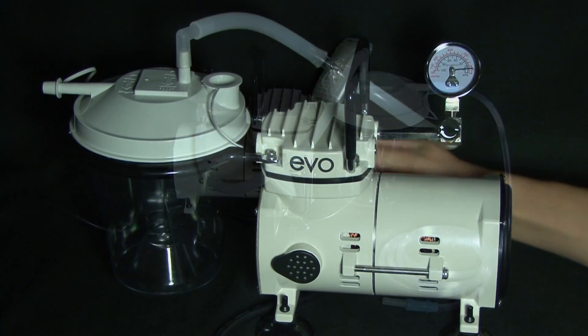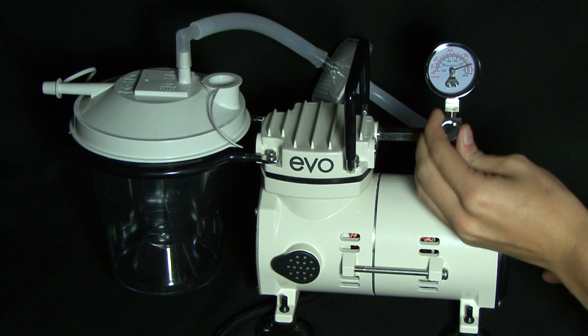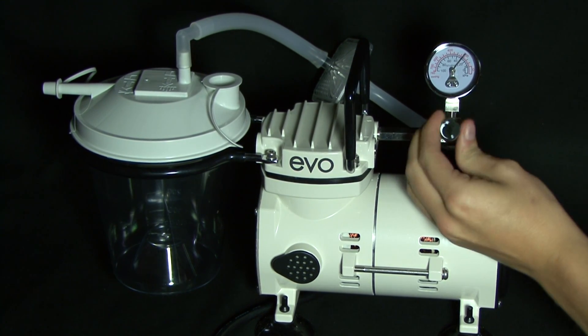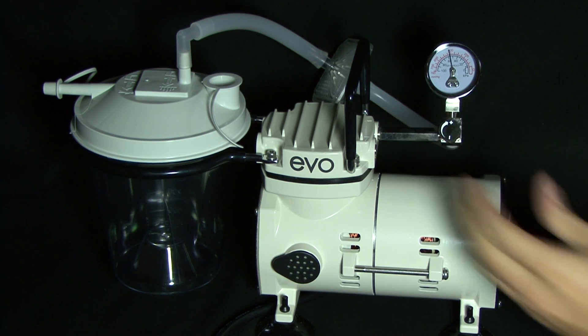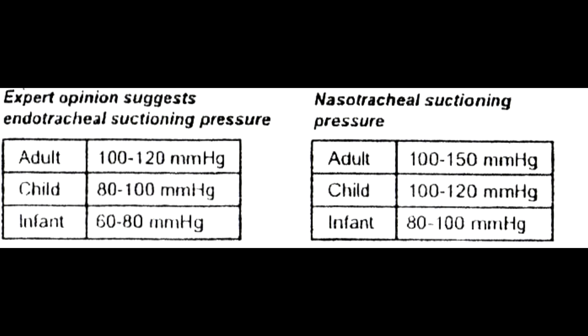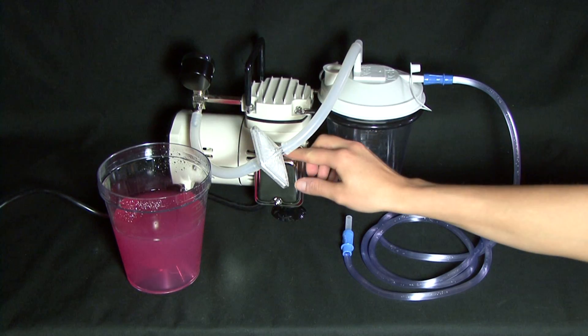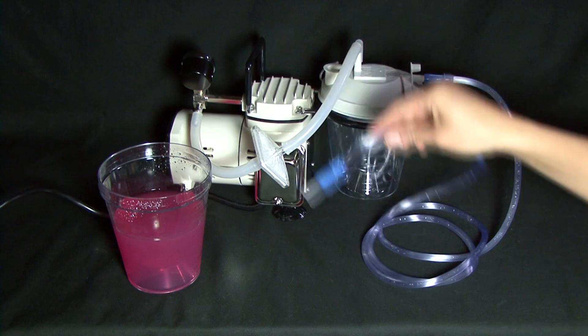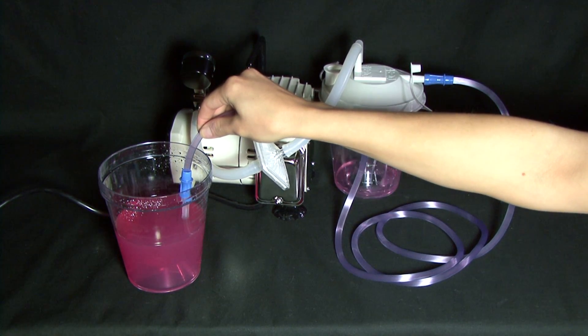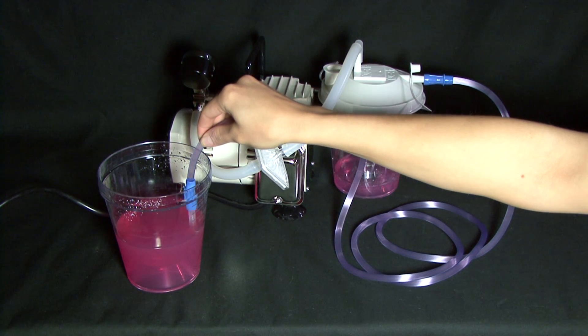Press the power switch to the I or on position and adjust the suction pressure to the ordered value to start the suction procedure. Refer to the instruction manual for expert suggestions for the endo and nasal tracheal suction pressures. Suction time should always be less than 15 seconds, and repeating suction should never occur before two minutes after each use.